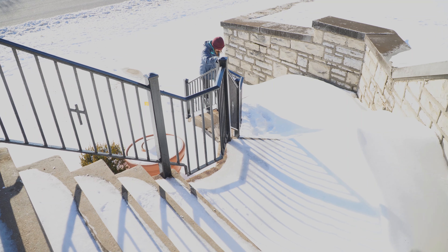You pretty much just have to watch what you're doing and kick out your knee a little more than you otherwise would. It's kind of fun.